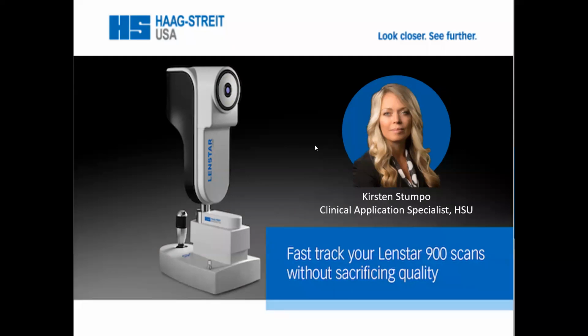According to the American Academy of Ophthalmology, the average ophthalmologist sees around 100 patients in a work week, which I'm sure you are well aware equates to a lot of testing. So I'm here to help make at least one of your daily tasks a little bit more efficient, but without the sacrifice of quality. So let's go ahead and get started.